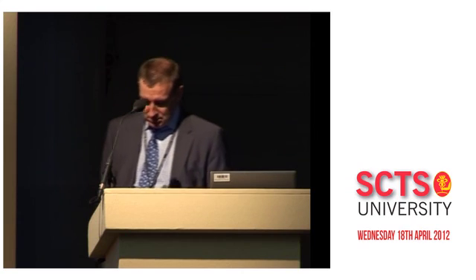They usually should have had them done if they're a cardiology patient anyway. Just going back to the AF, only one short comment. I would do it 3D full volume in 5 seconds. You get very good views of the left atrium on 3D.